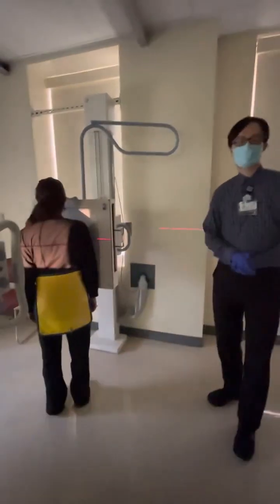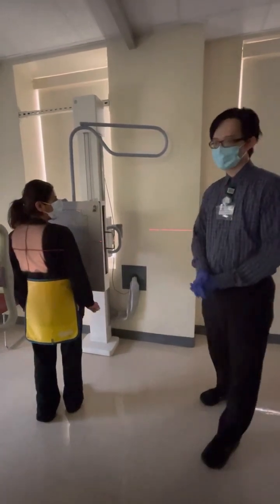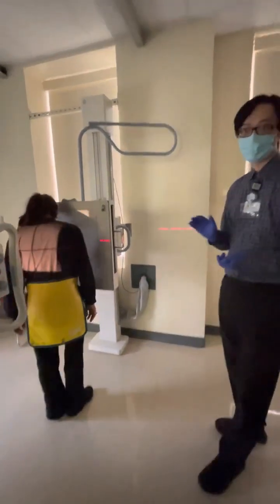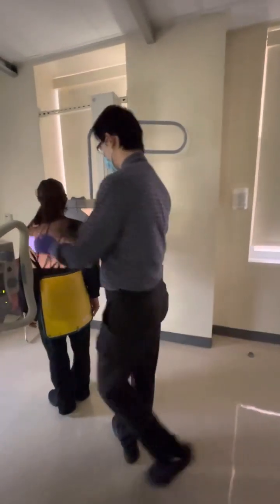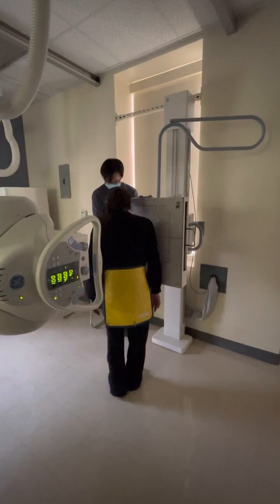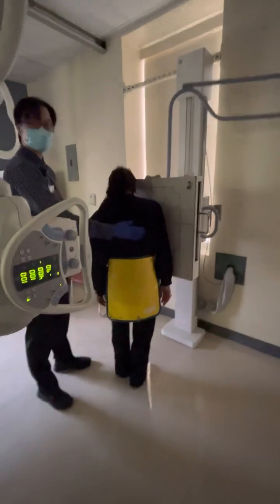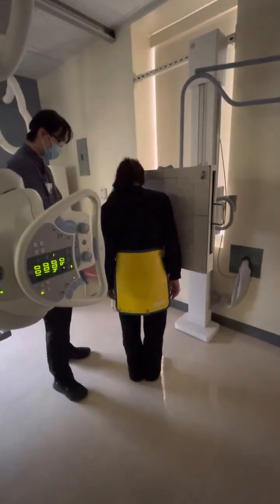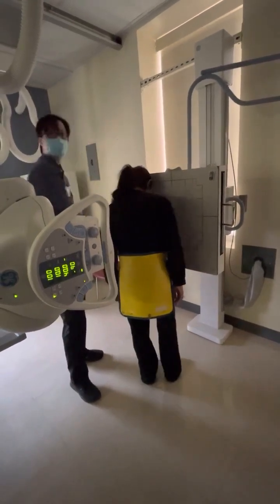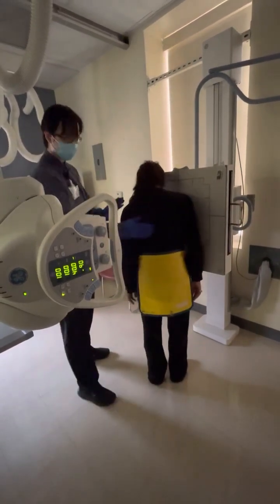Remember, how much do you turn your patient? 45 degrees, just like your chest obliques. Okay, so hopefully by now you have a better idea of what a 45-degree oblique should look like. Good. Point your toes towards me. Very good. So that's our nice 45-degree oblique right there. Feet also at 45 to help the body stay 45, right? Don't want the feet pointing towards the windows too much. Don't want them pointing off towards the side too much. Nice and 45. Good.